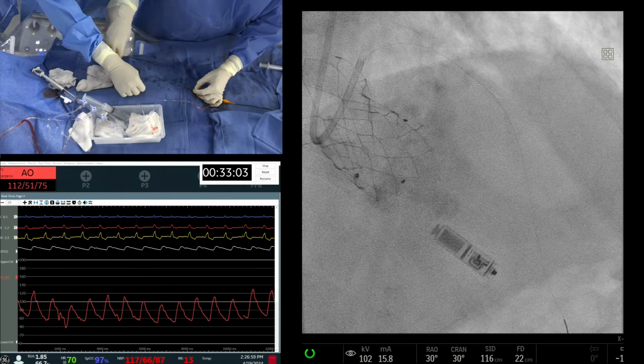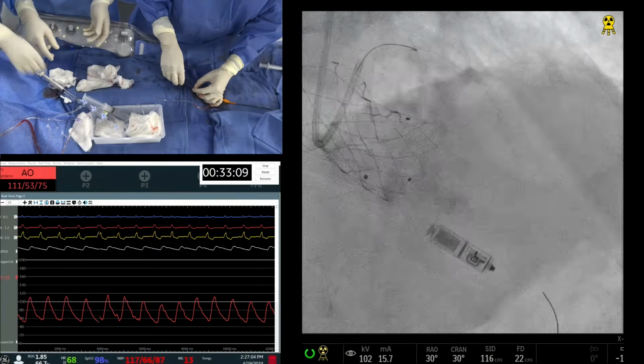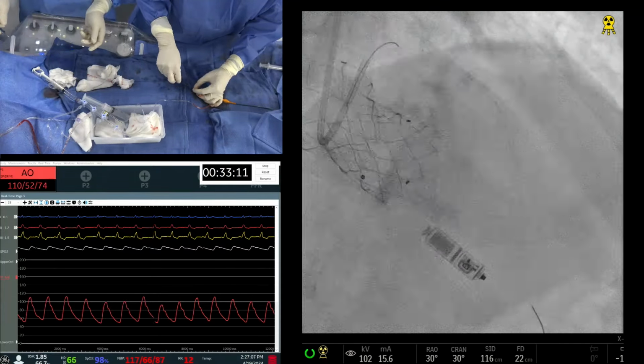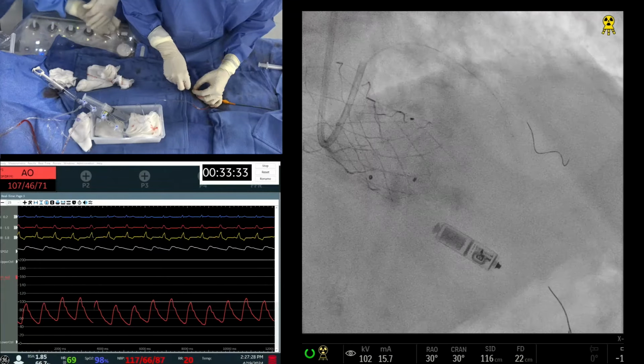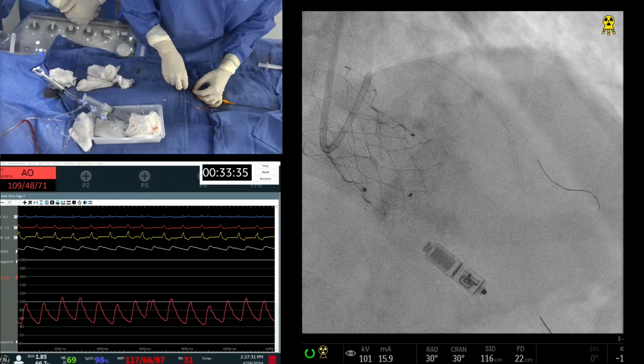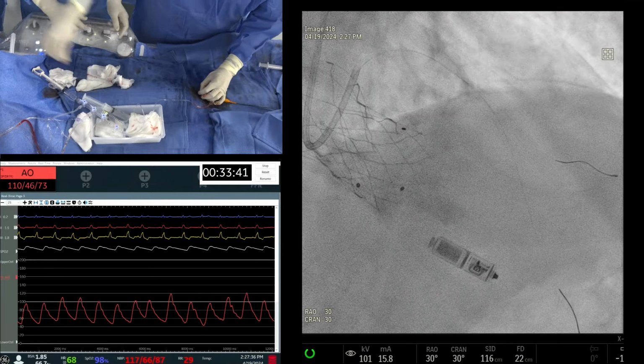If there is a dissection, then you can use an over-the-wire system so you remain in the lumen. But in this particular case, I think we wanted to show, and the same thing what Jess said, our goal is, can we do this case without atherectomy of that diagonal. That's the whole case. That's what we want to teach. We have so many other cases, but I think this is a real practical issue: in this day and age of IVL, the diagonal rotational atherectomy is where the trouble always occurs, if at all, perforation. So it should be a last resort if nothing else works.